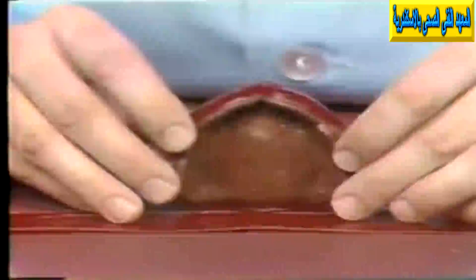So I simply open the strip up again, and it might take a couple of times to do this, but what I'm thinking in my mind is, by the way I put this on here, will I end up with the top of the cast approximately parallel to the residual alveolar ridges as a guideline. And once again, wrap it around. I think this time I'm going to be a little closer.